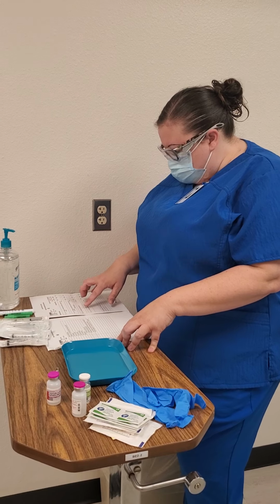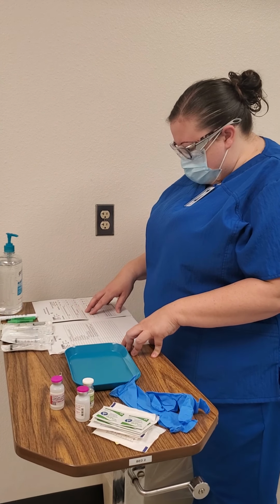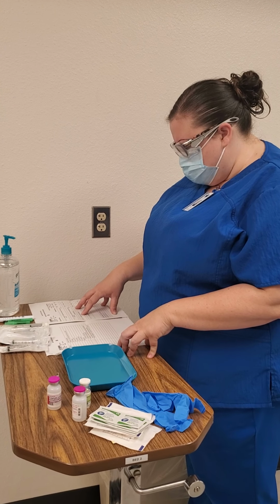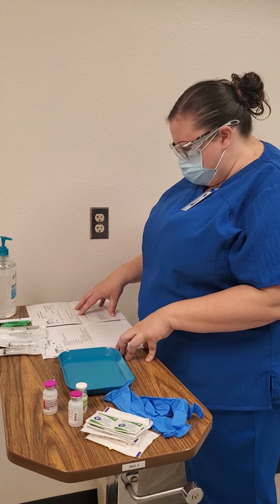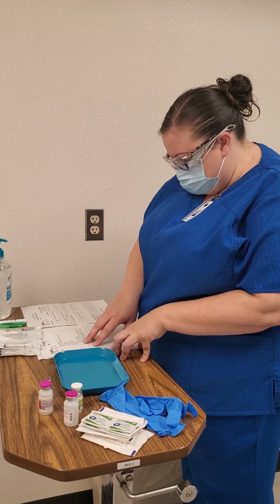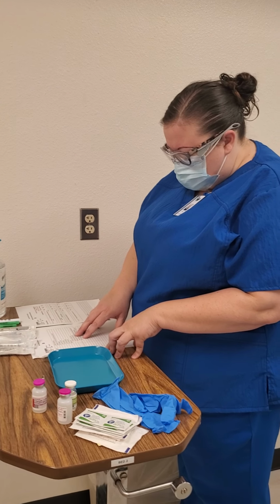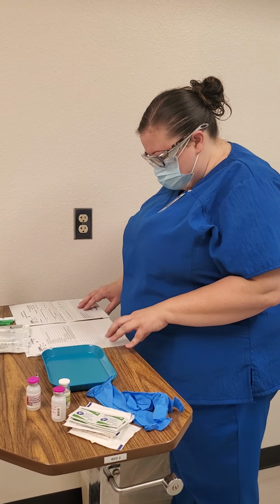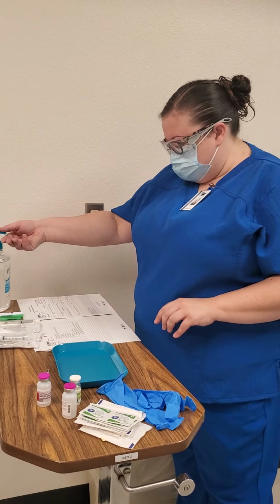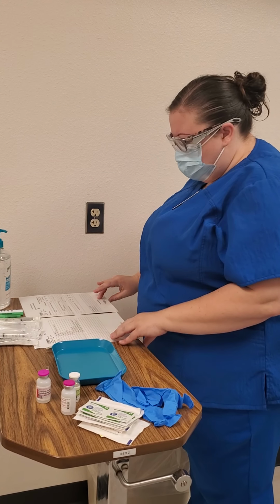The third one, which I'm just going to be setting up and not administering, is a ceftriaxone, 250 milligrams intramuscular, and that's also at 10 o'clock. The doctor's order says ceftriaxone 250 milligrams intramuscular, so that matches. Then for my second check, I'm going to be checking the medication against the MAR.